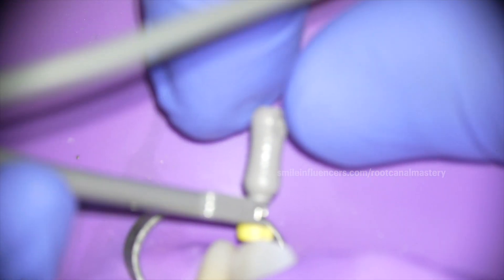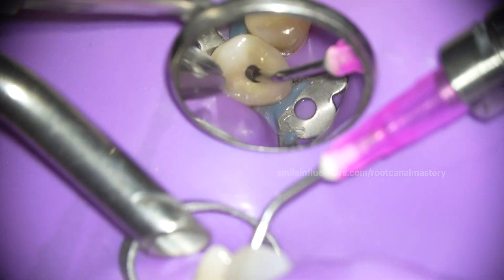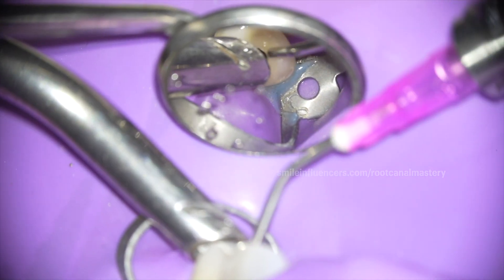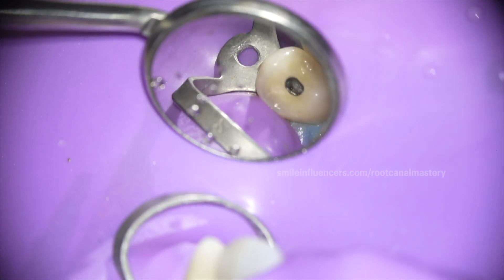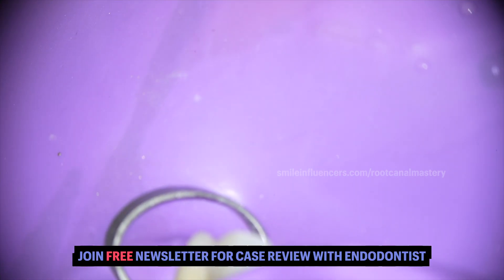You're gonna hear some beeping noises — that's okay, they help me measure. Right now it says it's all the way only because her restoration is forcing me to metal. So take it out. Metal conducts very well, so I just think that I'm touching the apex right away, but I'm not.